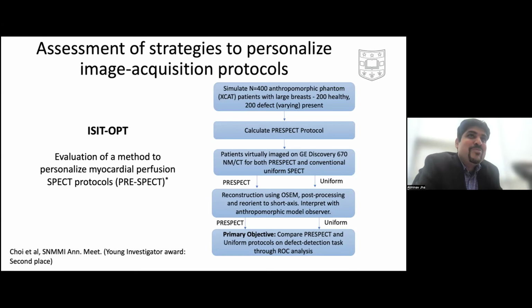Now, this was tricky because this was a personalized trial, right? So it's not a trial where you are having the same protocol for all patients. Here, you can have a different protocol for each patient, right? So you want to personalize, and I say this because, in the context of radiopharmaceutical theranostics, if we are thinking about personalized dosimetry, then we are thinking about how do we optimize the patient treatment regimen based upon things that we learn about the PK models, or from their initial PET scans, right? And then for different patients, things will be different.